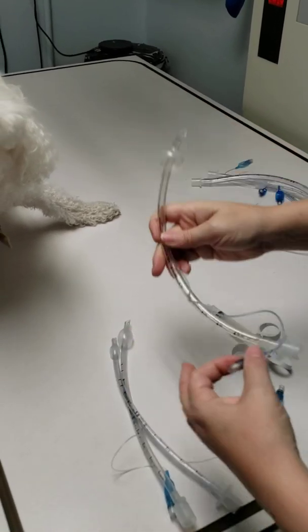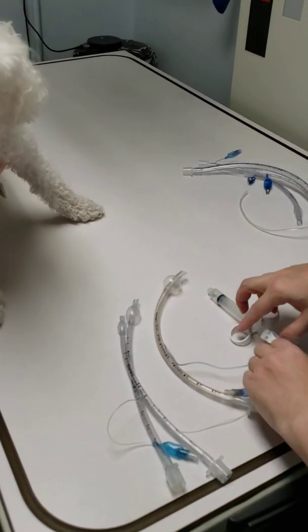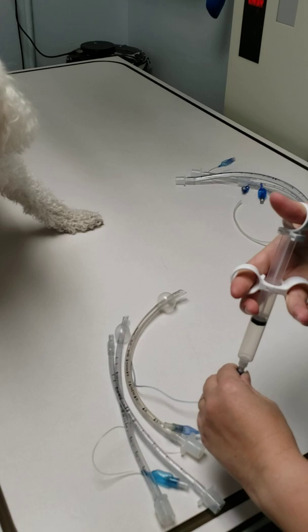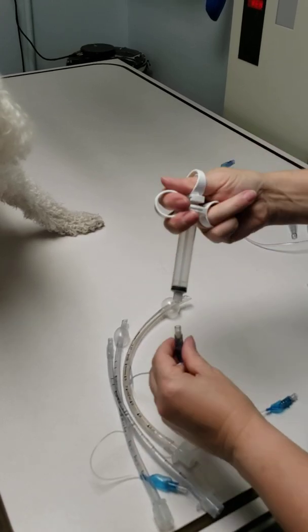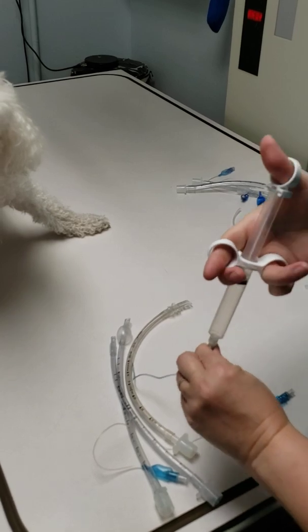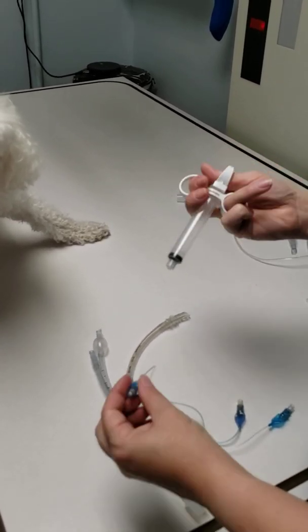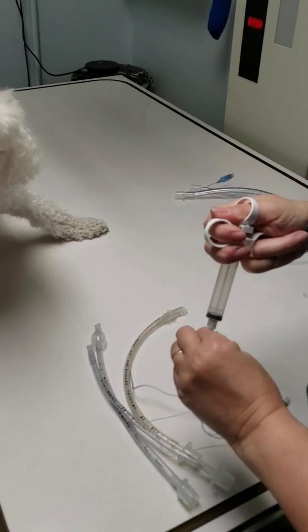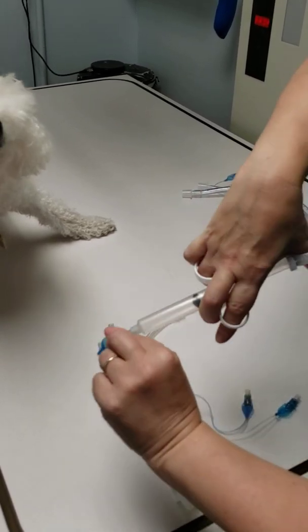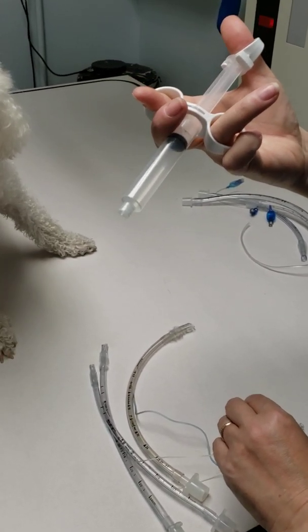Once you determine that your tubes are all good, deflate the cuffs. Hook it back up — usually you have to give it a little twist and then suck out. While you're doing this, take a mental note of how much air you put in there. My syringe doesn't have markers on it at the moment, but it's about six cc's.